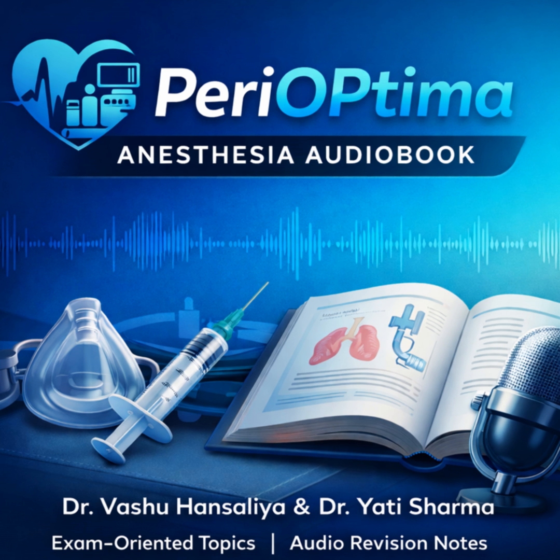Which brings us perfectly to pressure support ventilation, or PSV. You call this the comfort mode. It is. PSV is a purely spontaneous mode. There is no set rate. The patient has to trigger every single breath. So what does the machine do? The machine simply provides a boost of pressure during their inspiration. Let's say you set a pressure support of 15 centimeters of water. When the patient starts to breathe in, the machine gives them that 15-centimeter push to help them overcome the resistance of the breathing tube and inflate their lungs. It's like power steering for breathing. That sounds very comfortable for the patient.